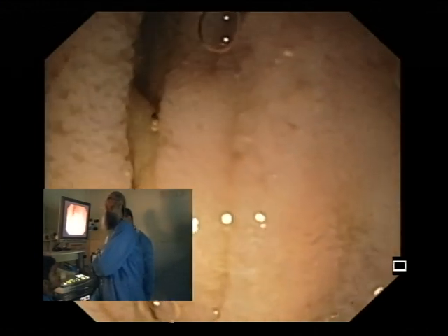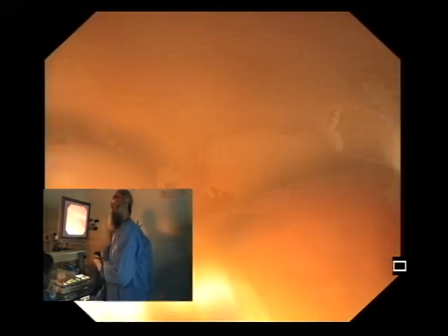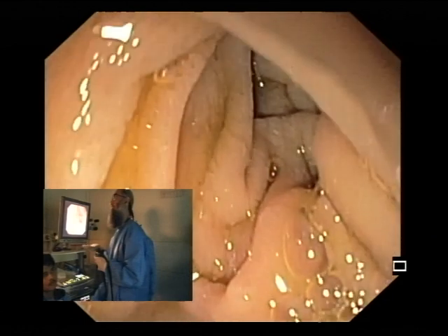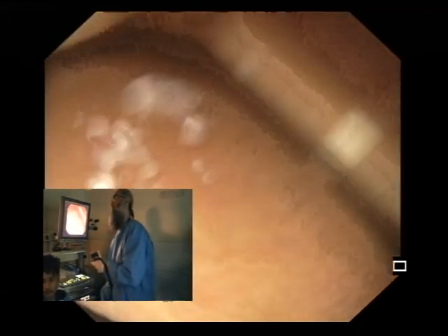I think you'll go. Make sure your thumb is all the way down. There you go. Or pull towards you. So thumb down, like remember it's like an ERCP, so yeah, thumb down. But I would actually reduce right now. I wouldn't advance. No. You can, okay, let's try again.